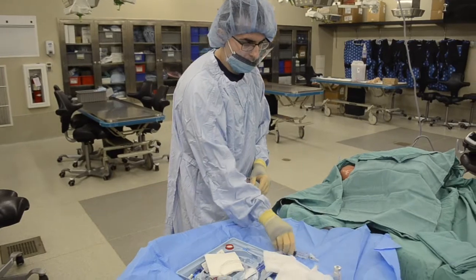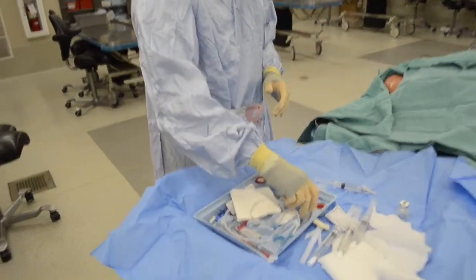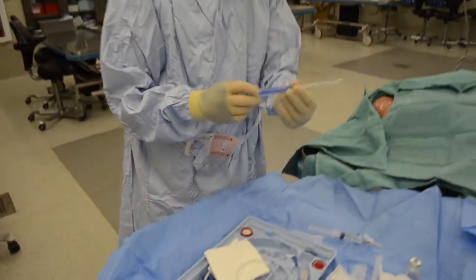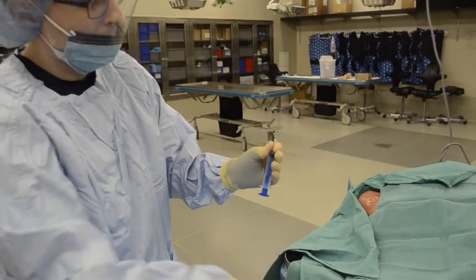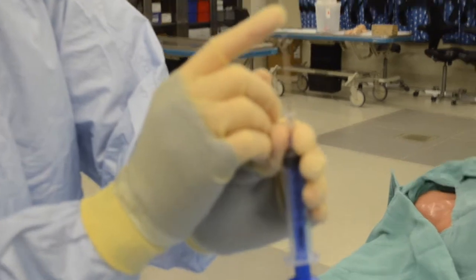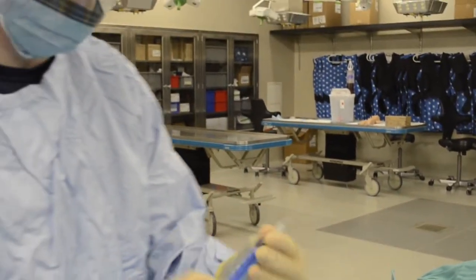We can set that aside. The next thing we'll need is the needle. This is our introducer needle. There's a few things I want you to pay attention to. One is the bevel. The bevel is that little point where the wire is going to come through. So that needs to be pointed up when we do the procedure.